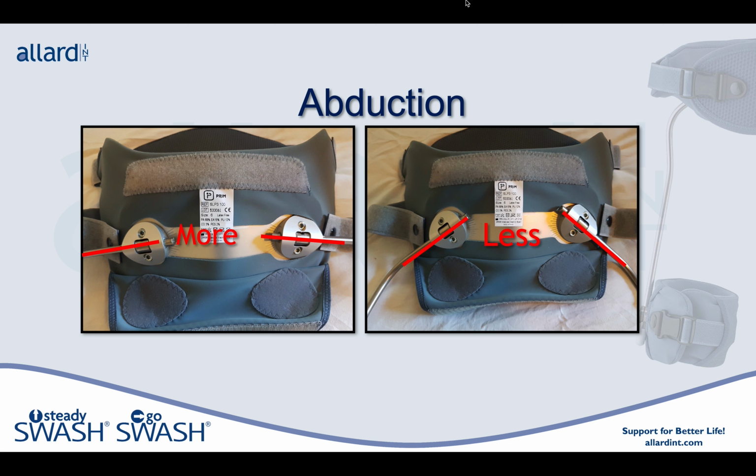If I put it on a different child and that 1 inch of separation I have, the child is still scissoring, I need to provide more resistance to that child. So I go back to the joint assembly. I look at the left-hand side of the screen. I see I would rotate the joint assemblies upward. So upward provides you with more resistance. Downward provides you with less resistance.